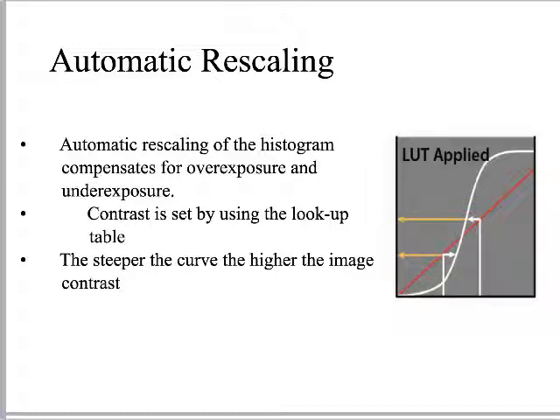Because I can't see all these little tiny whites and blacks and all the thousands of grays that the computer can. So I've got to make it pop a little bit more in order for people to be able to see it. And that way of making things pop, if you will, is to apply an H&D curve to it, right?